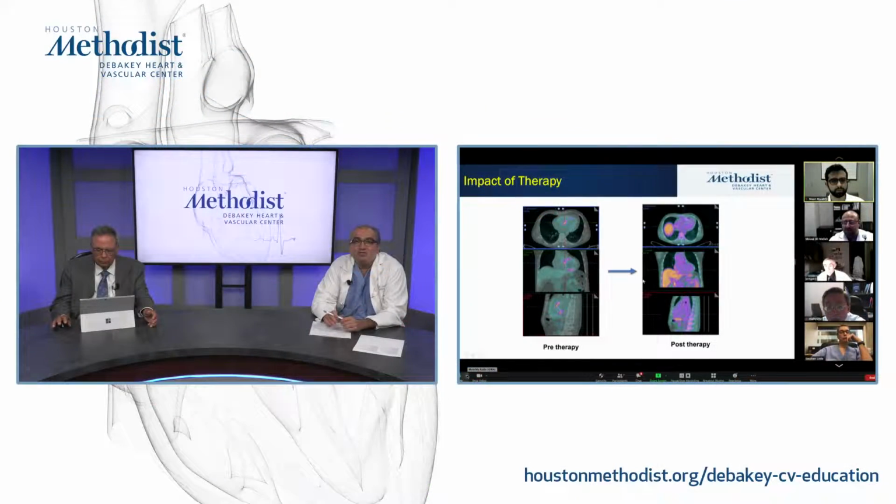So Mouaz, let me ask you a quick question on the first case that you showed that was a perfusion case. My understanding right now is that most of the PET tracers don't allow you to do exercise. You have to do pharmacologic. Is there something in the future where you can actually do PET perfusion imaging coupled with exercise? Because that would be the ideal scenario.